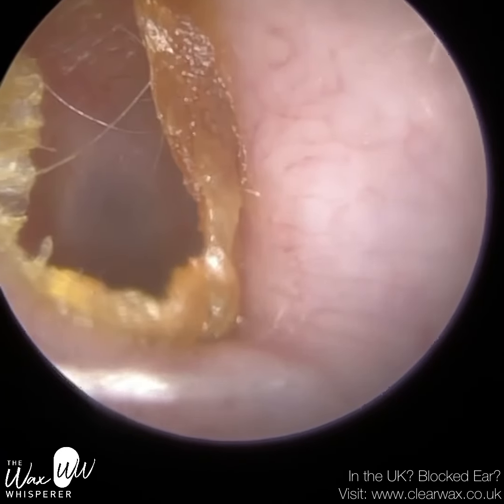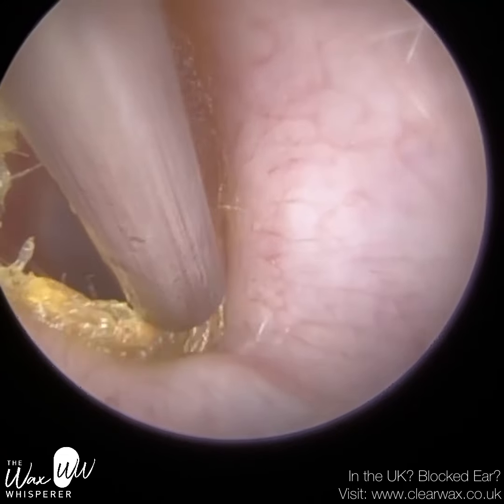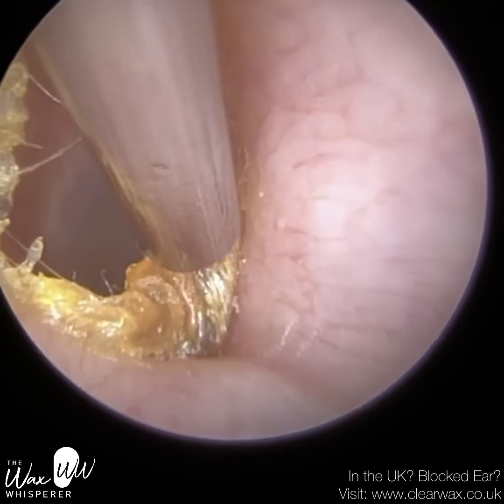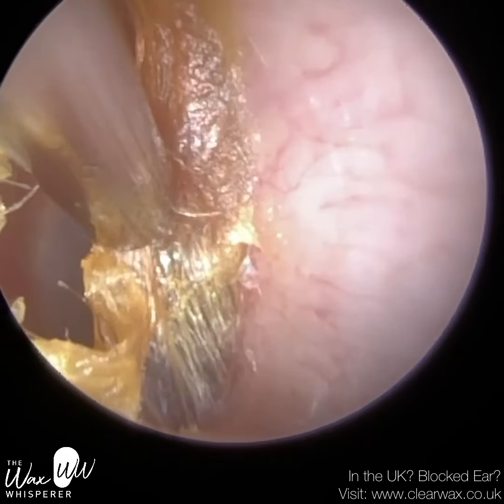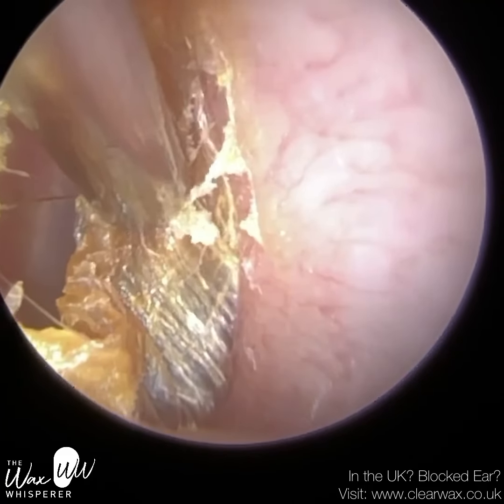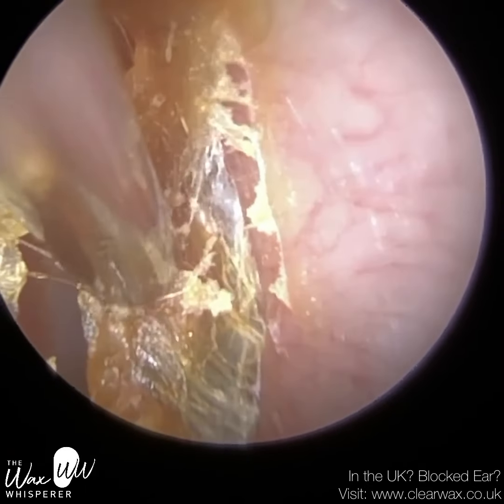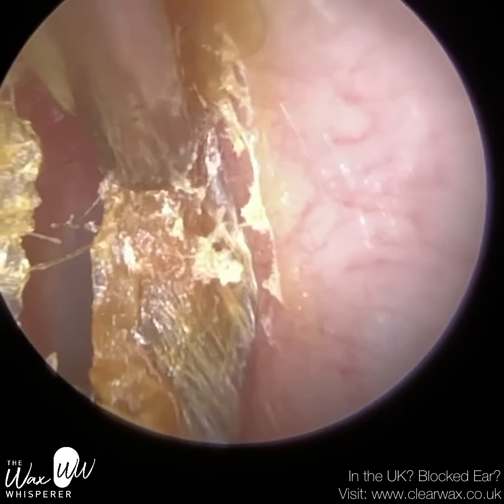This is the same patient — it's just their right ear. You can see the eardrum there. They also wear a hearing aid in here. They weren't experiencing any problems here, but whilst they were here today I just decided to get this out for them, because I'm pretty sure in the next few weeks this is also going to get blocked and then I'll have to come back.